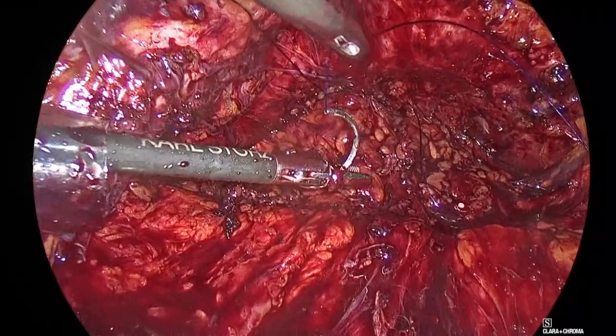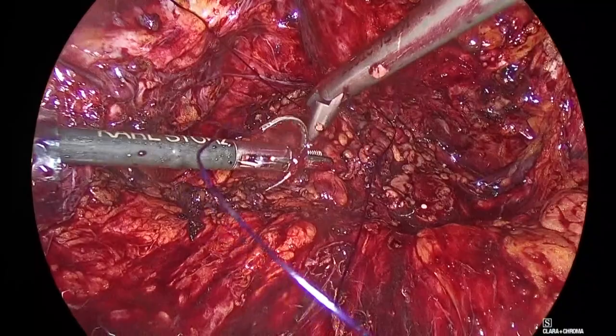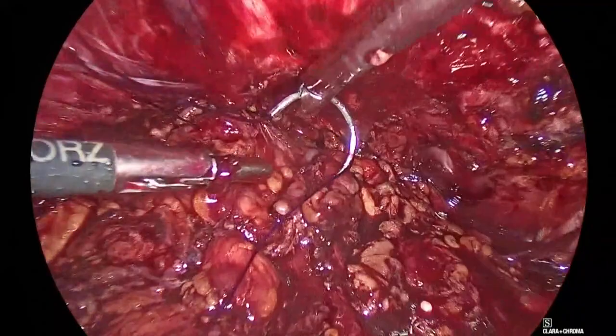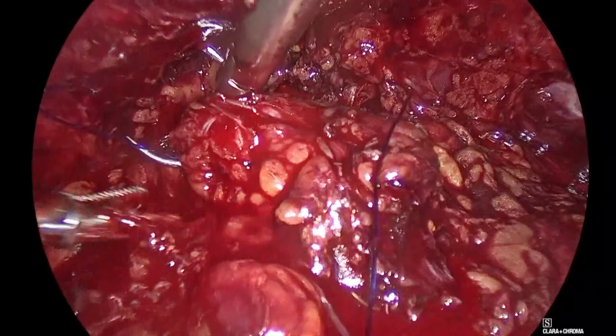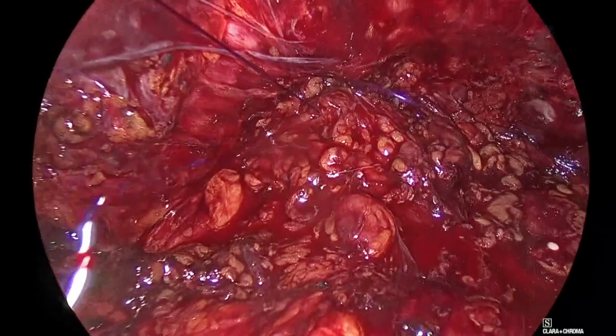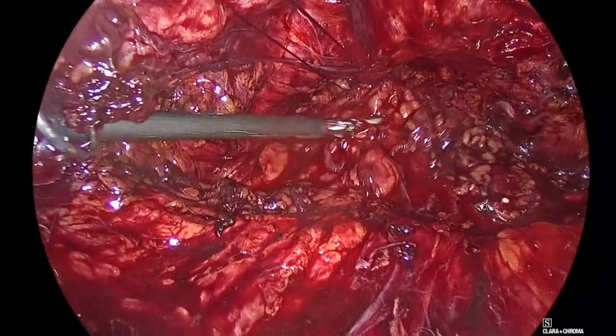It comes in easier. You see the angle is changed. Come in, come in. Loosen, Panagiotis, loose. Okay. Tension, Panagiotis, tension. Good. Take off your catheter. Take off the catheter, yes. Replace it, put the silicone catheter inside.